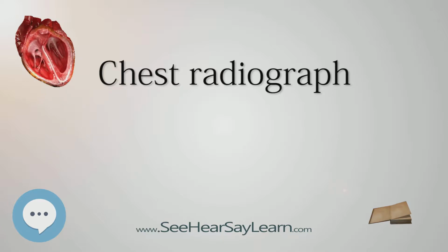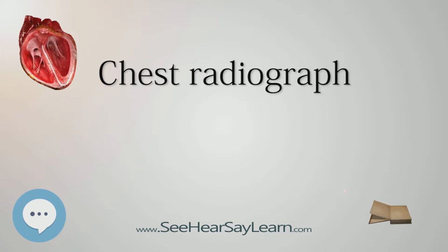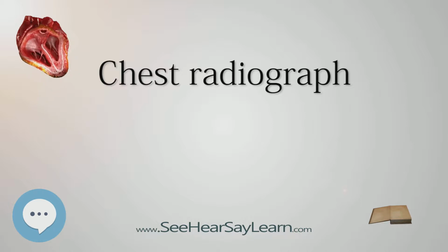In the UK, the standard chest radiography protocol is to take an erect postero-anterior view only, and a lateral one only on request by a radiologist. In the US, chest radiography includes a PA and lateral with the patient standing or sitting up. Special projections include an AP in cases where the image needs to be obtained stat and with a portable device, particularly when a patient cannot be safely positioned upright.